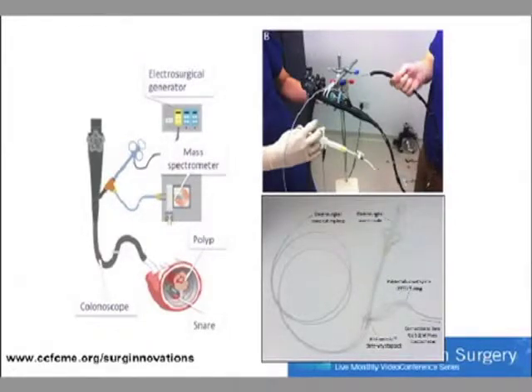It's certainly something that we're extremely interested in. So I'm going to present to you the colonic work here. So what we were able to do is simply take a standard endoscopic setup with a standard endoscopic snare. We attach a little bit of PTFE tubing to the side of the snare so we can aspirate gas as you use a standard electrocautery instrument. So we typically use cutting diathermy on a standard setting. We need a very, very small amount of tissue to burn to get data out of it.